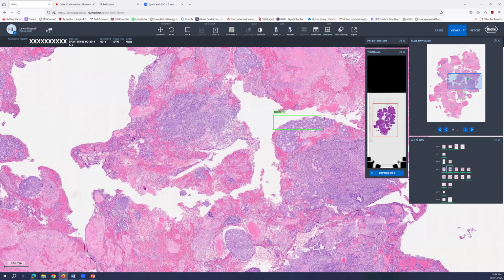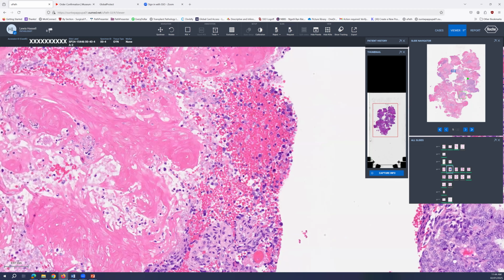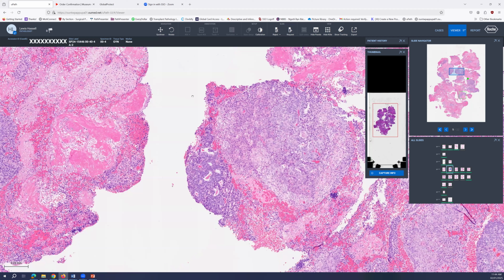Now, the other interesting features here, as I mentioned, were these areas of keratinization, which, as you can see here, are quite numerous, and they're in this little nested pattern, similar to what is often seen in keratin granulomata that can be present either in association with certain invasive tumors and on occasion even within the peritoneum, where they may mimic or masquerade as areas of metastatic neoplasm.